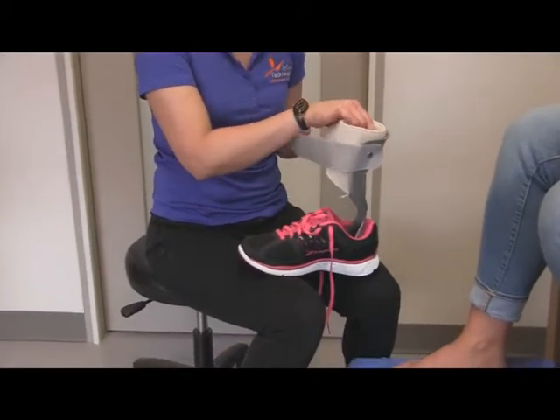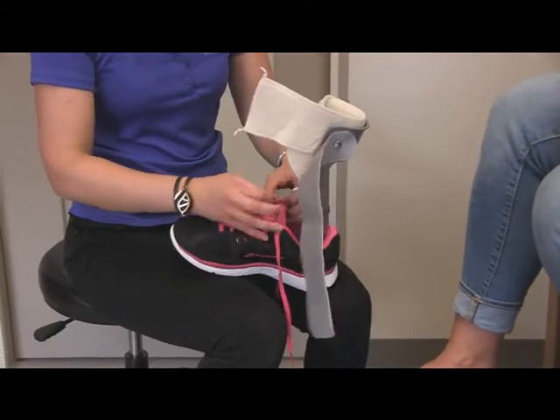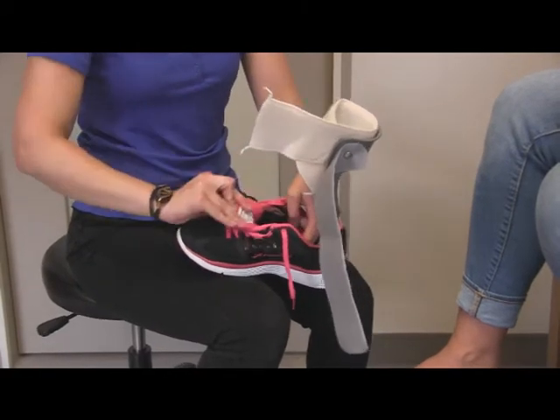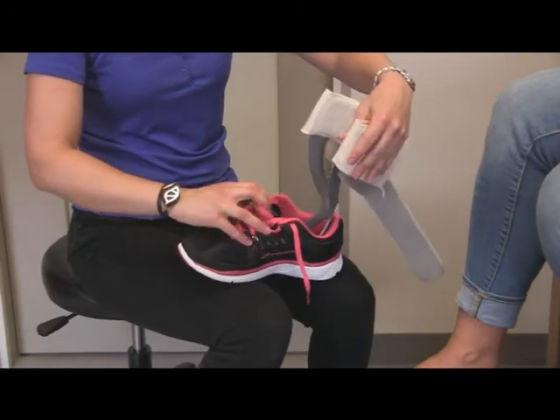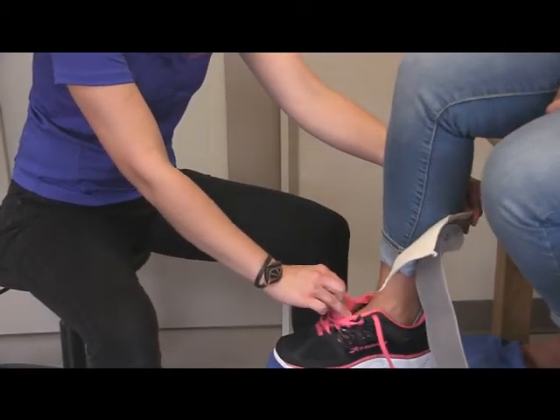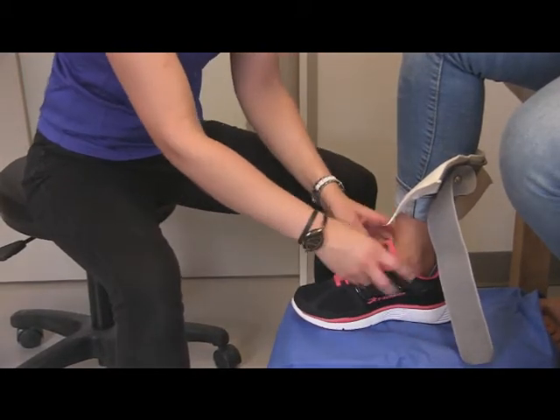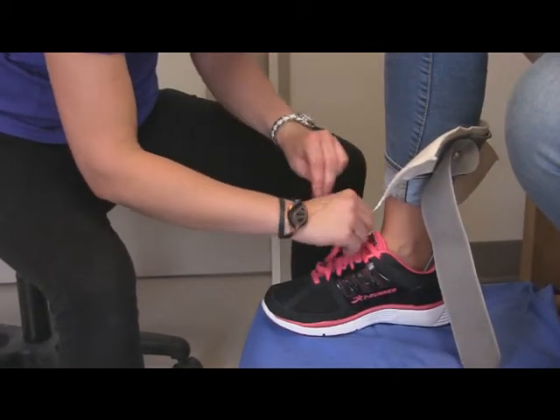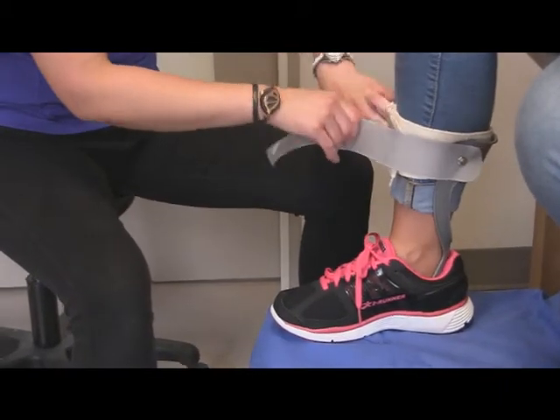If you're going to be putting it on the first way, having the brace in the shoe first, you'll want to loosen the laces as much as you can in order to open up the tongue across the top of the brace. The patient will then want to place her foot in the brace and, using the brace as a shoe horn, slide her heel down into it. You can then secure the shoe as you would normally and secure the calf strap around the calf.